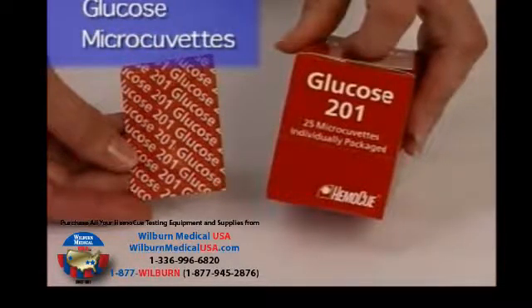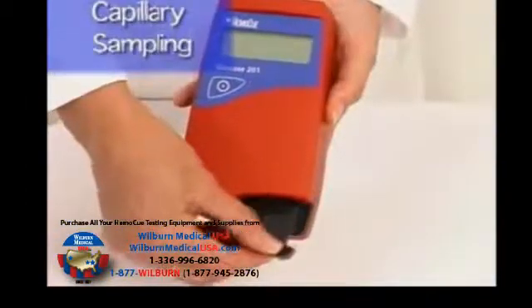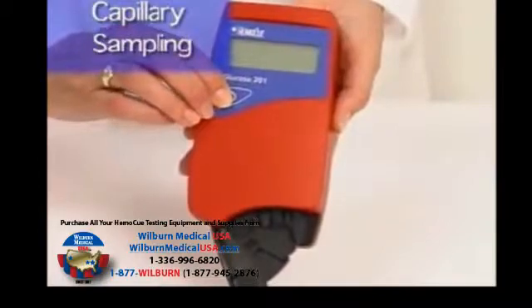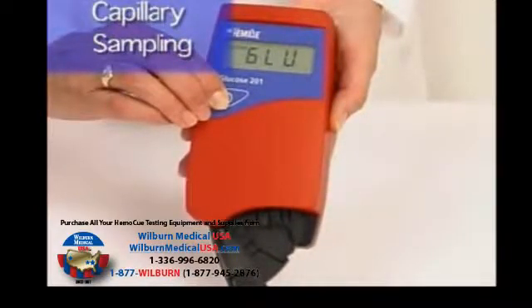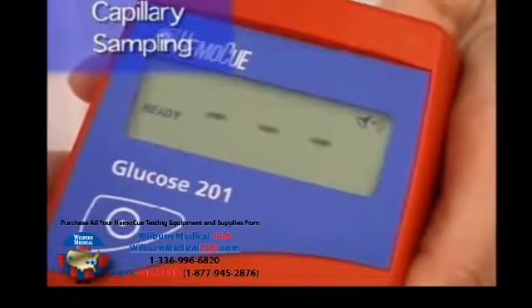To perform a capillary sampling test, first make sure all of your capillary supplies are ready for testing. Pull out the cuvette holder to the loading position — noted by a distinct stop which should not be exceeded. Turn on the analyzer by pressing and briefly holding the on/off switch on the front of the unit. The display shows self-test and the version number followed by the letters G, L, U. After approximately 15 seconds, the display shows ready with three flashing dashes.